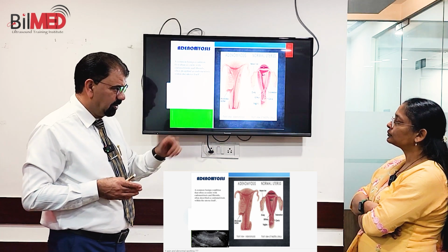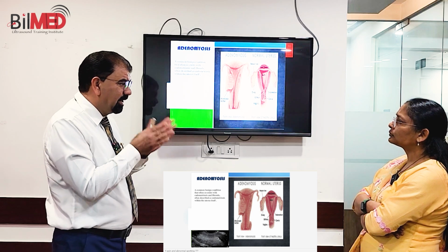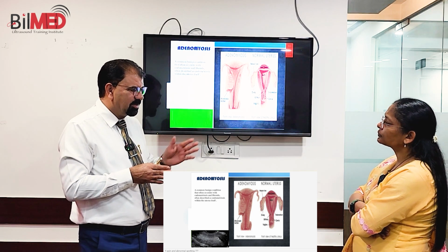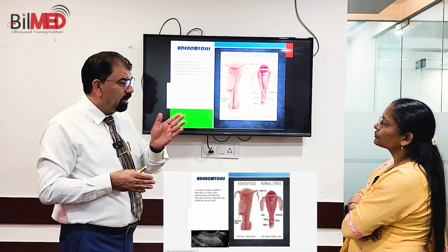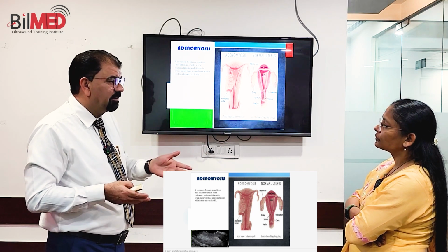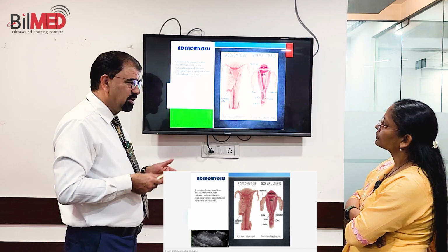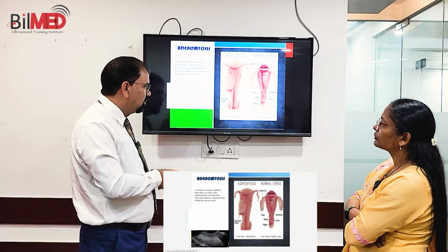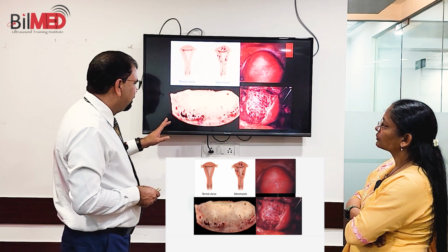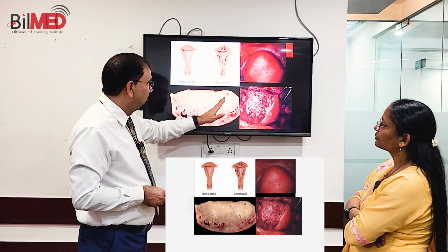Before ultrasound, if the patient is having intermenstrual bleeding, spotting I will say, not bleeding, spotting, and cyclic pain, that is going in favor of adenomyosis. Then you have to put a probe to see what? To see a patch over there. Now, when I say patch, it can be anywhere.